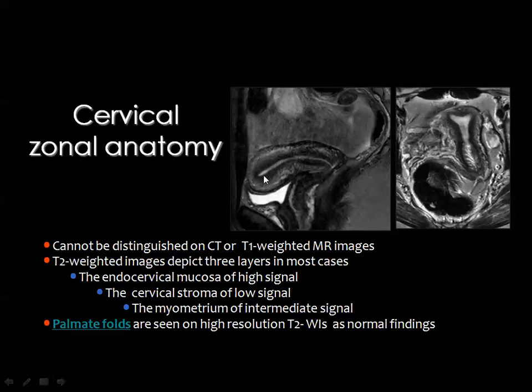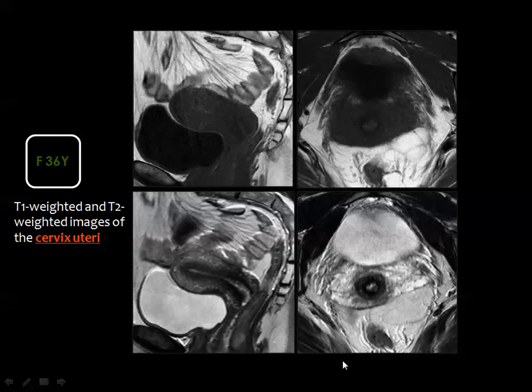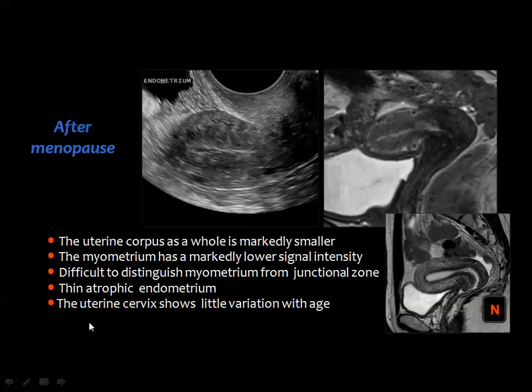The cervix has different anatomic details compared to the uterine body. An important feature to notice is the presence of high-signal folds within the endocervical canal, known as palmate folds, which are a normal finding. On T2-weighted images you can see the cervical stroma and cervical canal, whereas on T1-weighted images these details are masked.